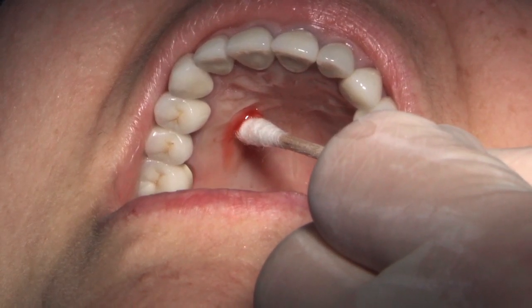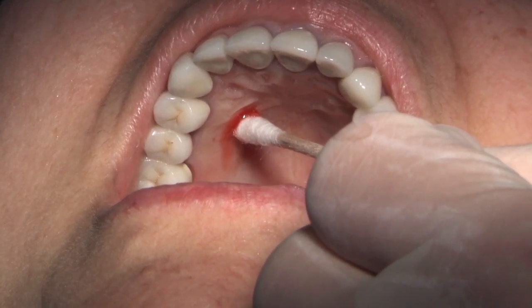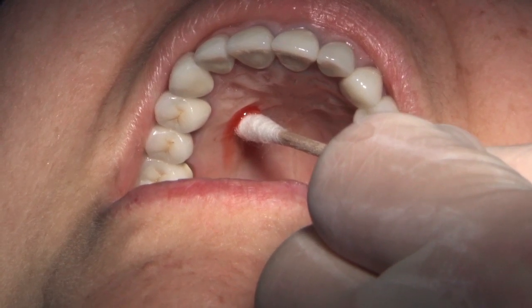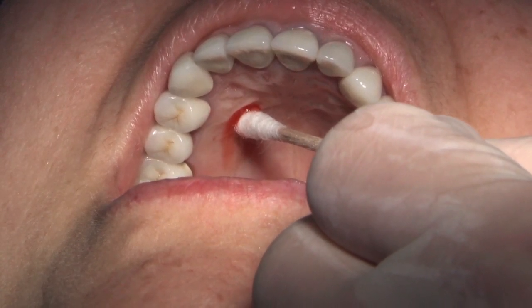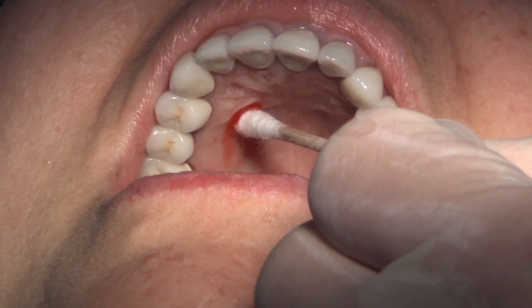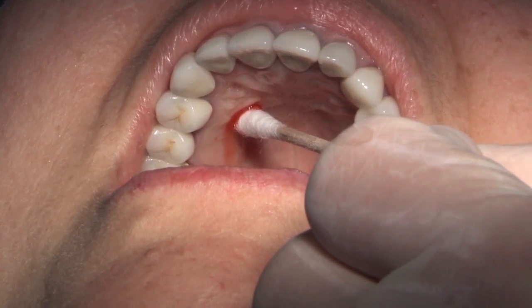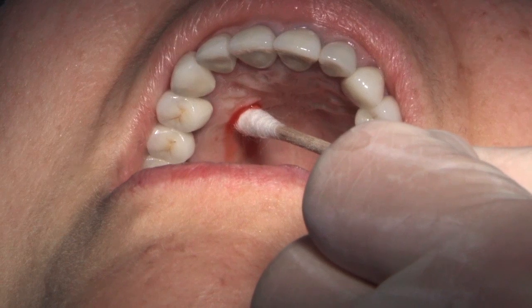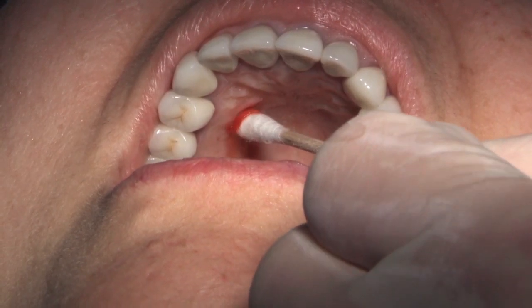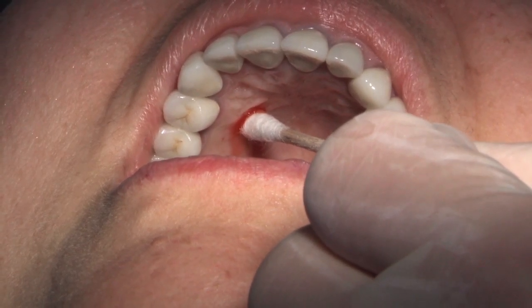With the pre-puncture technique, you hover the bevel right at the tissue and use a sterile cotton swab to compress the lumen right at the bevel against the tissue, getting that first drop to enter right on the tissue. Rather than having topical applied previously, you're actually depositing the drug itself from the very initial penetration through the tissue. It takes using two hands together — some people are comfortable with that, others aren't.